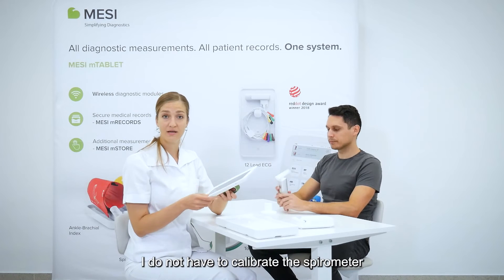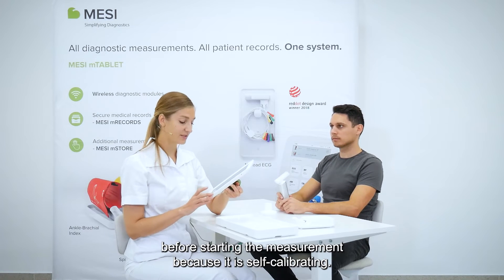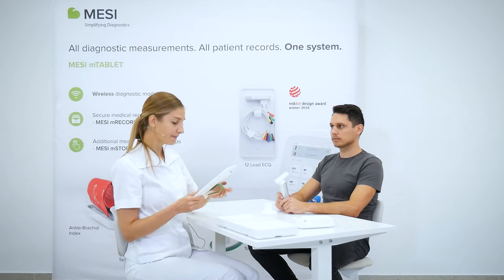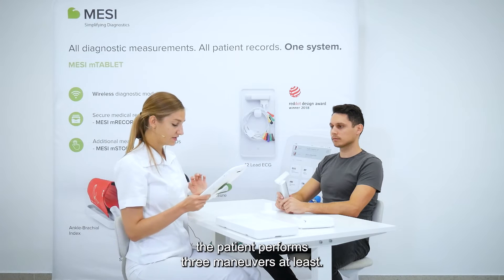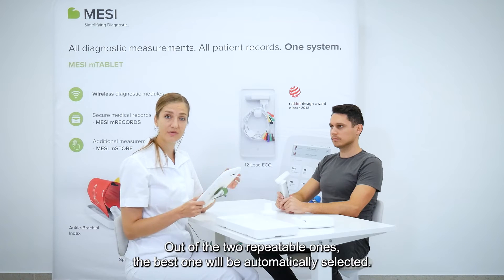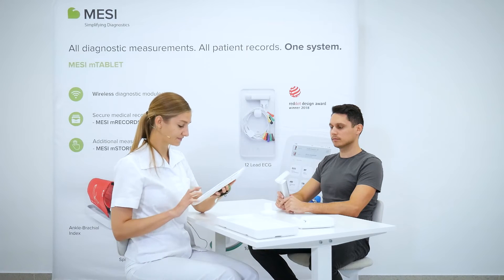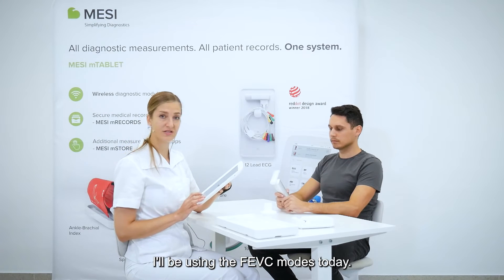I do not have to calibrate the spirometer before starting the measurement because it is self-calibrating. The patient will perform at least three maneuvers, and out of the two repeatable ones, the best one will be automatically selected. I will be using the FEVC mode today.